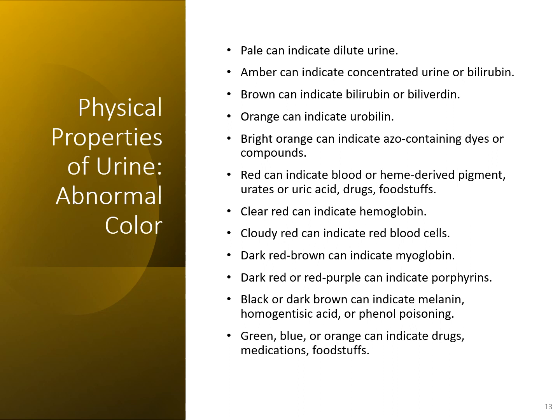So with color of urine, like I mentioned, there's a variety of colors that you can see. And here's just a list of some of the causes of the different colors that you can see. So for example, a pale urine, sometimes close to being colorless, would be something that's very dilute. So it could be that someone diluted it themselves, or they could just be a person that drinks a lot of water, and so they've kind of diluted it out by drinking so much water.